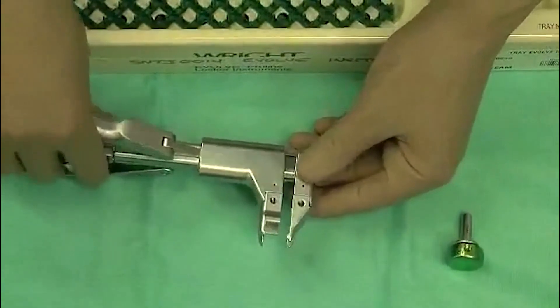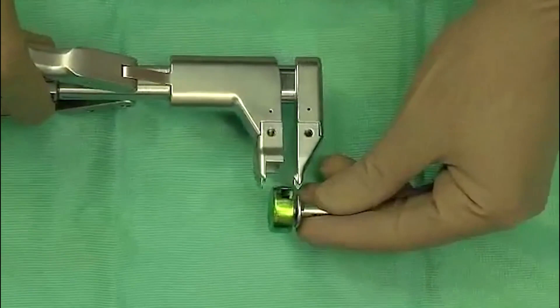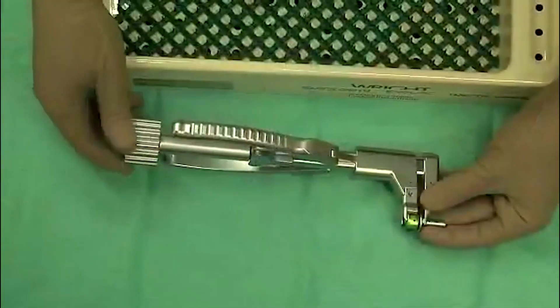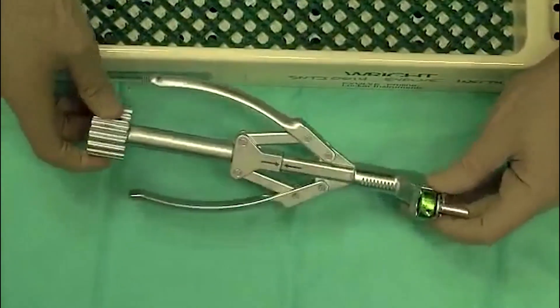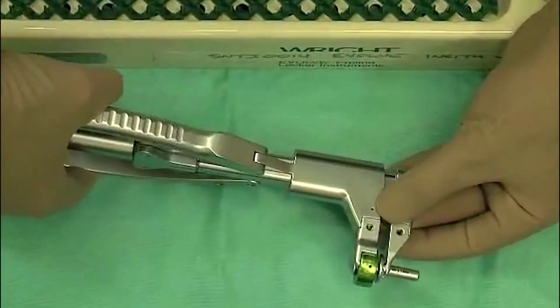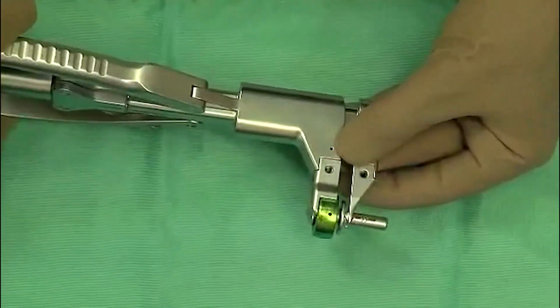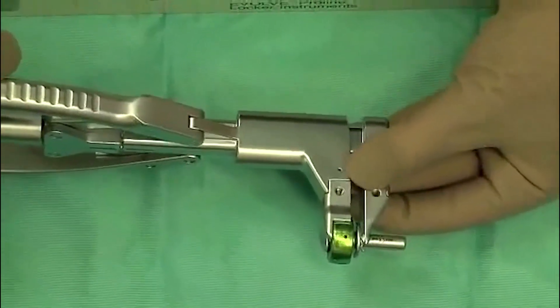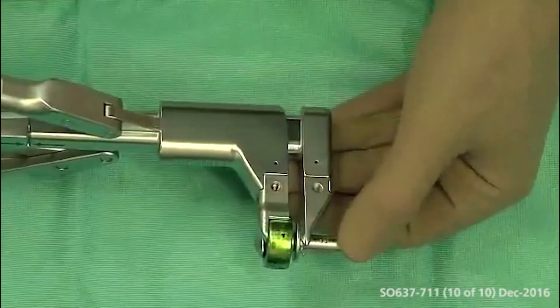The locker is slid over the implant in the patient. This large bolt is tightened to compress, and then by squeezing the handles, we apply a large load to the Morse taper to ensure dissociation of the implant does not occur. This is very effective — it has been shown to apply more than 1,000 newtons of compressive force, which will prevent the implant from dissociating. It is not satisfactory or sufficient to simply tap the radial head onto the radial neck.